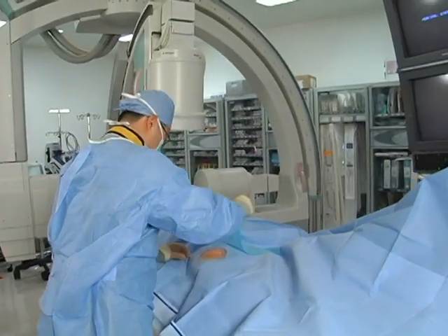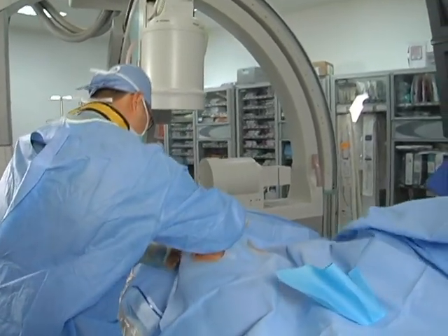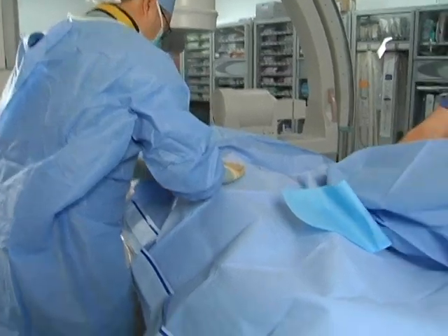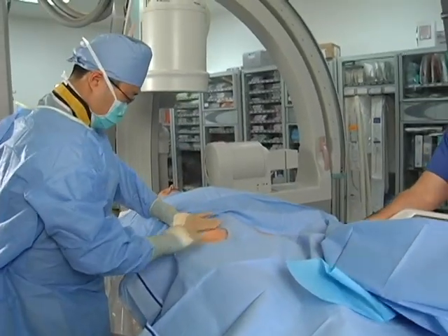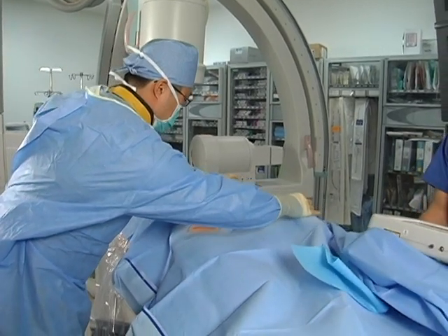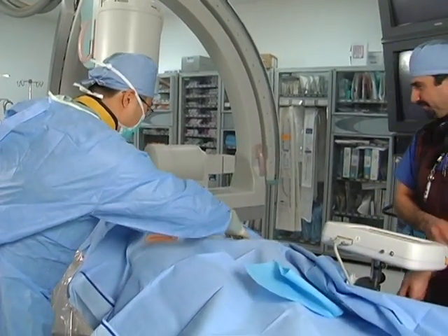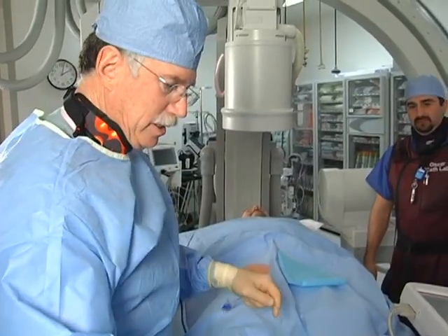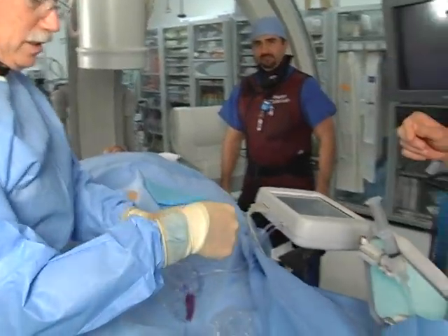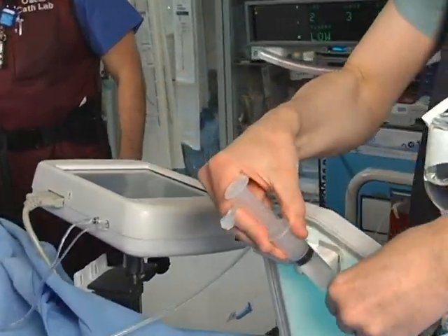It is important to position the holes over the femoral artery and vein, and this is done by palpation and slight adjustment of the access ports. Once the drapes are in place, the connecting tubing for the injector system is passed off the field, and connection to the angiographic injector is made. Pressure manifolds are connected, and then access is obtained.